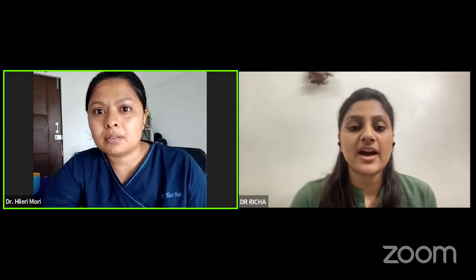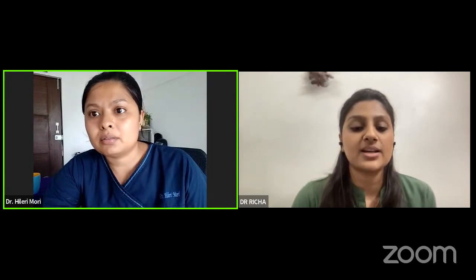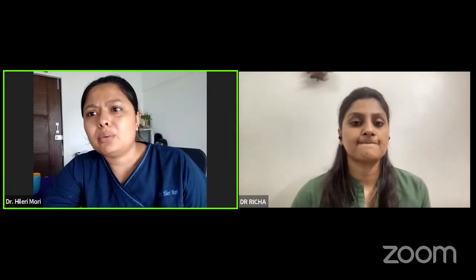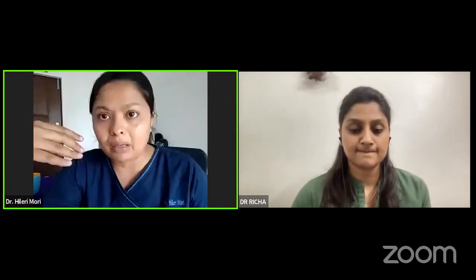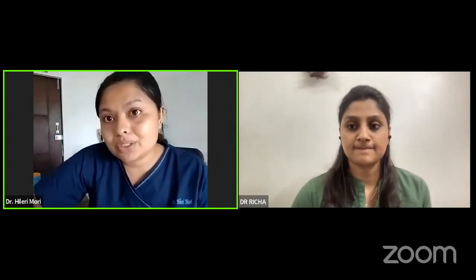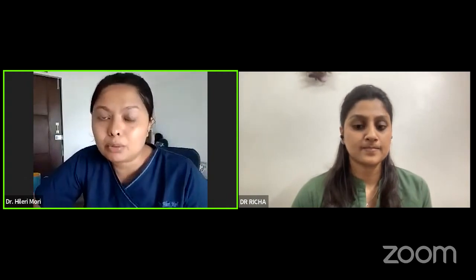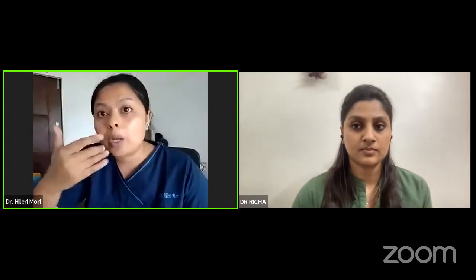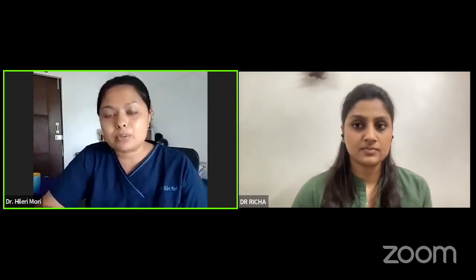So we can now start with the Q&A section, Doctor. Yes, there's one question. Are there any factors we need to consider before using a scanner in any patient with comorbidities? No, if you have a good mouth opening, you can use intraoral scanners. There is no contraindication related to any medical comorbidities. In patients with OSMF or trismus, where mouth opening is very limited, you cannot use intraoral scanners because of accessibility. That's it.